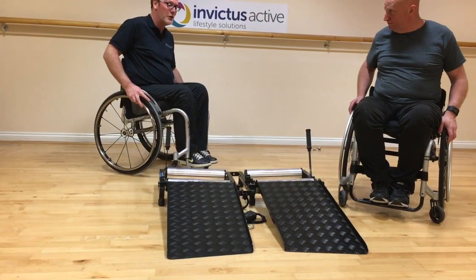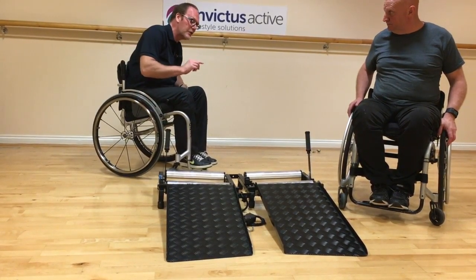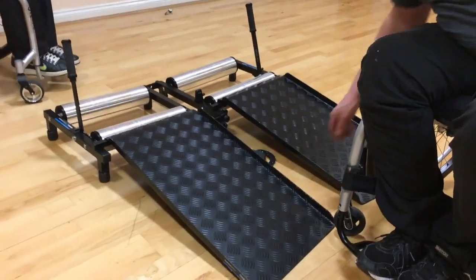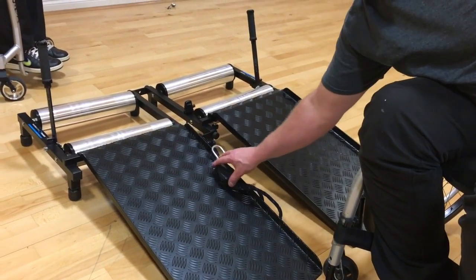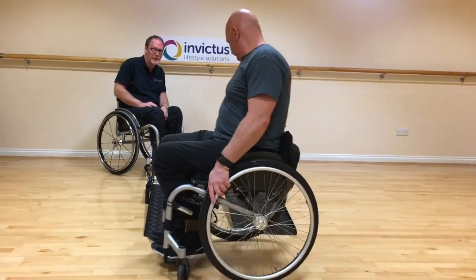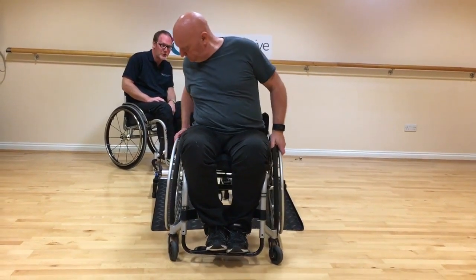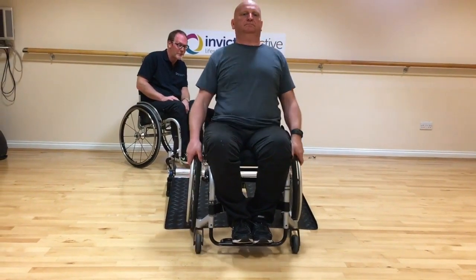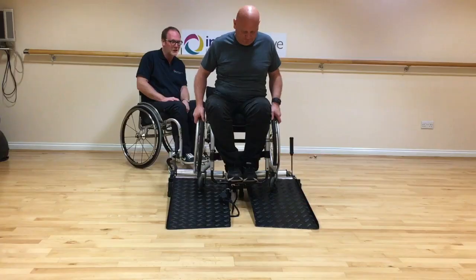Now for the first time, wheel onto the trainer. Just before you do, make sure the ratchet strap is placed in a convenient position that you can reach once you're on the trainer. Position yourself at the bottom of the ramps facing forwards, get your wheels in the centre of the two ramps, then get your balance and wheel straight up the ramps into the rollers.